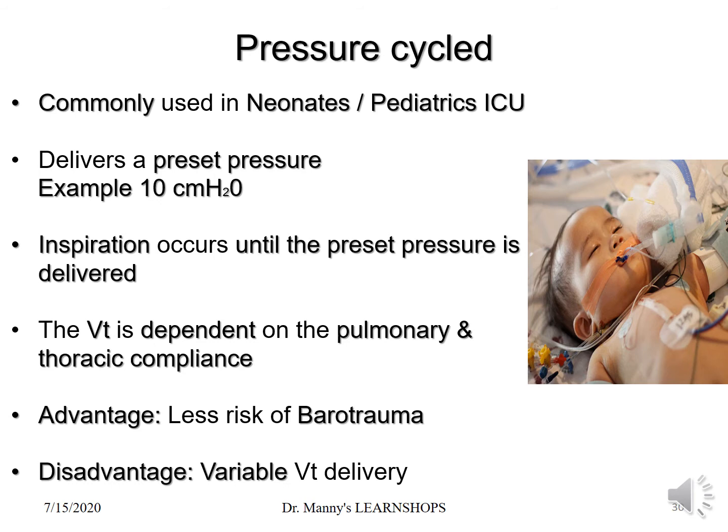Then you've got pressure cycled ventilators, and these are more commonly used in neonates and paediatrics in their relevant intensive cares. And this delivers a preset pressure, for example, could be from 10 to 20 centimeters of water. And inspiration occurs until a preset pressure is reached and delivered. The tidal volume, however, is dependent on the pulmonary and thoracic compliance.